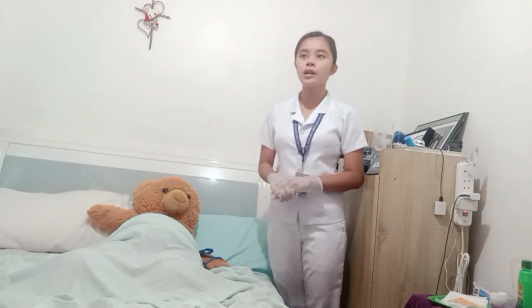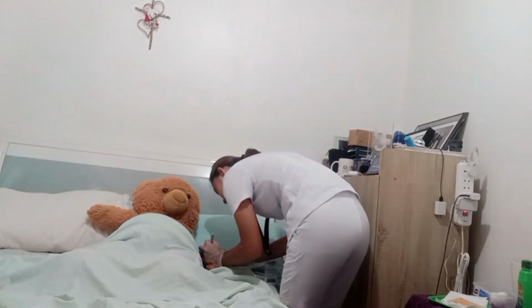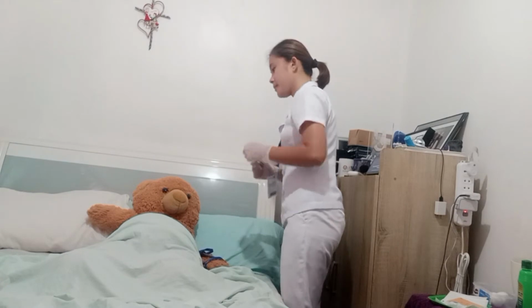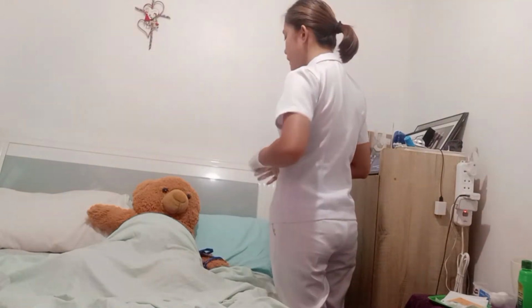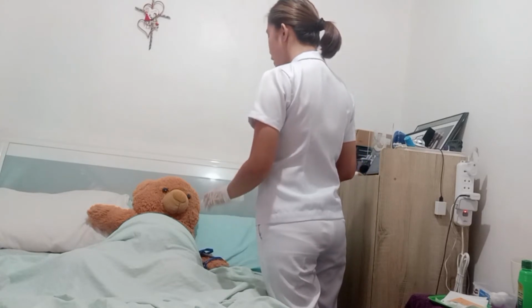Use a blue or black pen only because red pen may influence the reading, and instruct the client or the watcher not to rub the wheal or erase the mark because massaging the area may influence the test result by spreading the medication subcutaneously. So as well, please do not rub this area for a few minutes to get an accurate result.